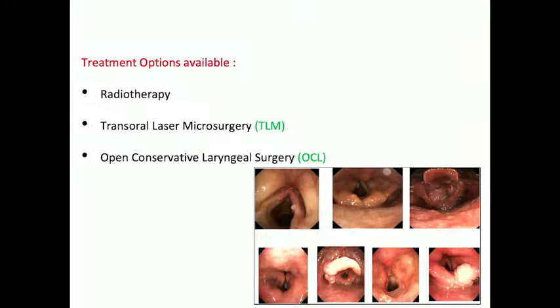They just treat the scans, which is hardly visible. In a T1 vocal cord, when you see a scan, it's hardly visible. I don't know how they plan without having an understanding of an endoscopy, right? So no doubt it has an excellent outcome.